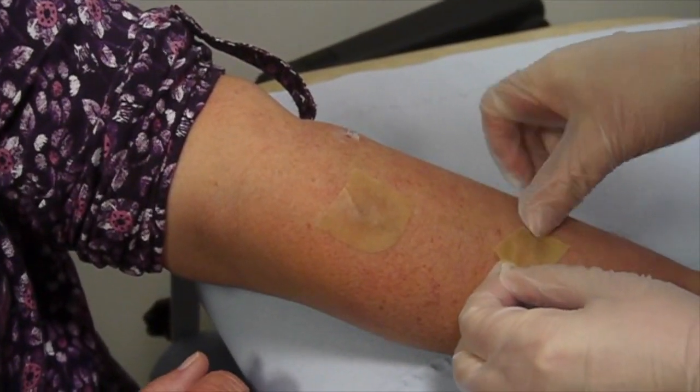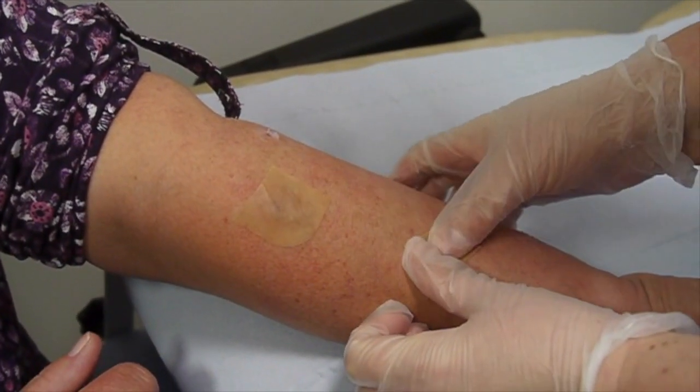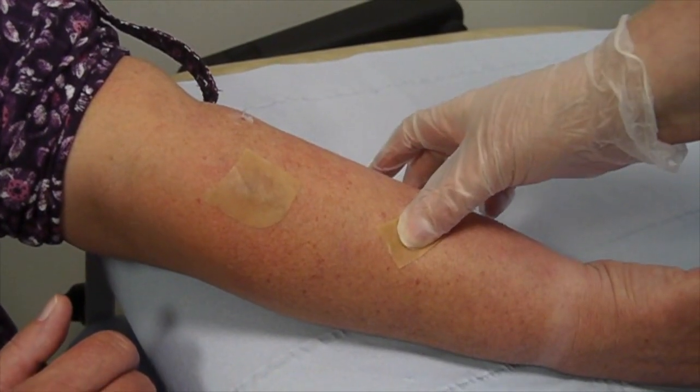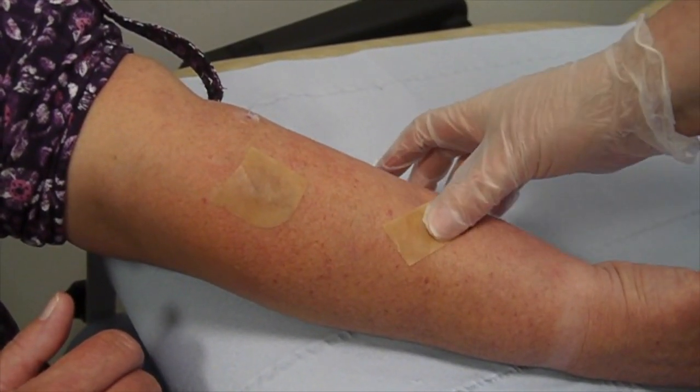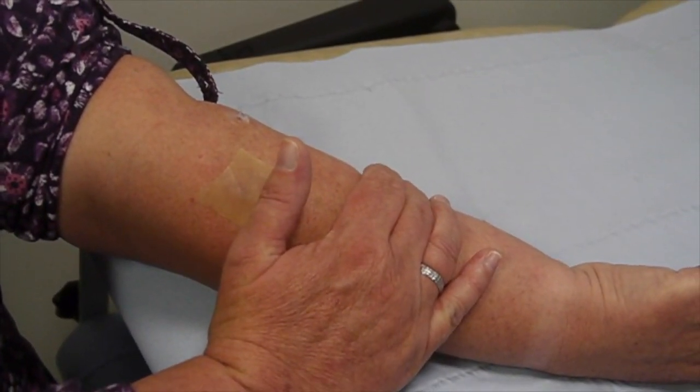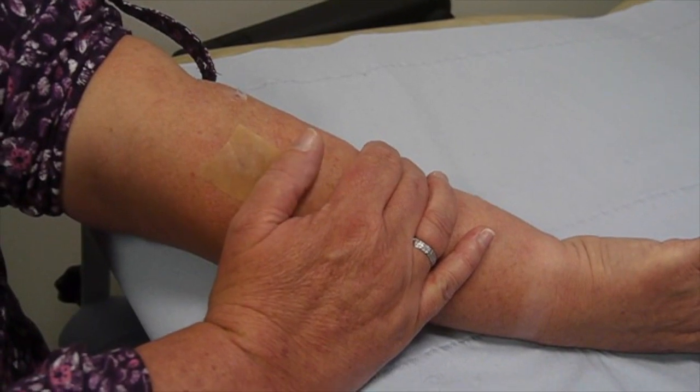These pieces of dressing can be left in place for two to three days. They're waterproof — you can bathe and shower with them. The hydrocolloid dressing can then be taken off and hopefully the eczema will be much less itchy and flattened down, and the whole process can be repeated for two or three occasions until the eczema settles.